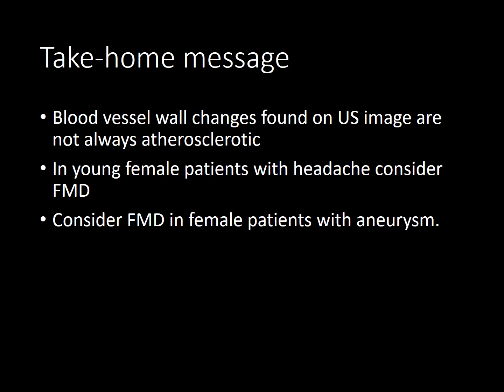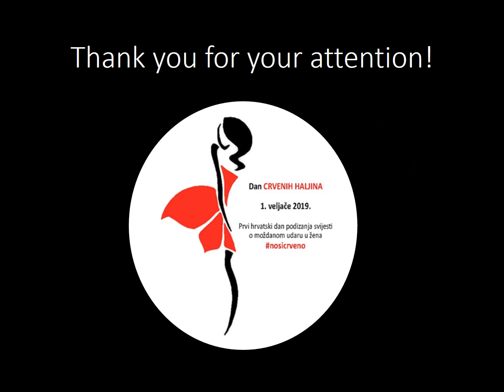So the take-home message would be: blood vessel wall changes that are found on ultrasound images are not always atherosclerotic. In young female patients with headache, consider FMD, and also consider FMD in female patients with aneurysm. I'd like to thank you for your attention.